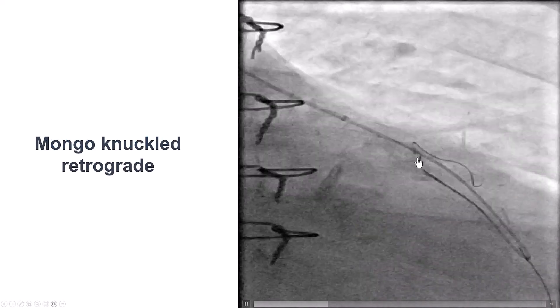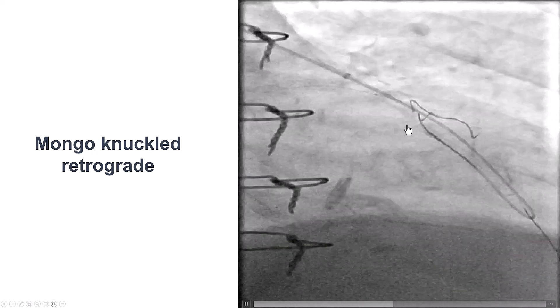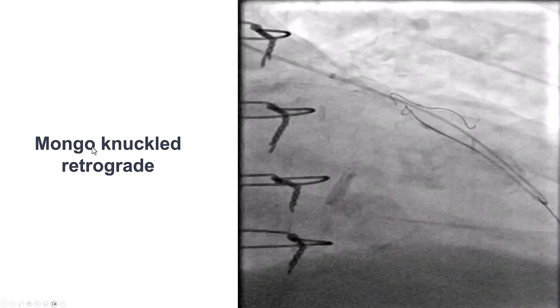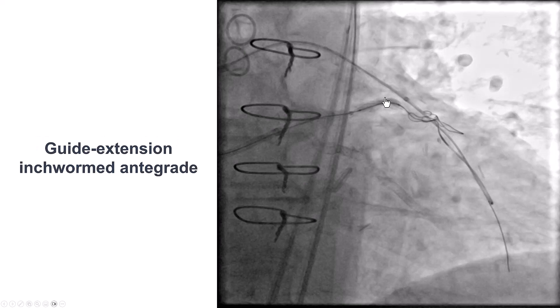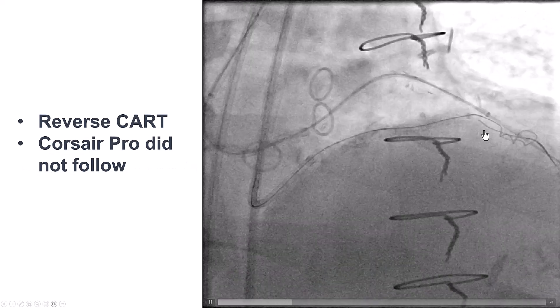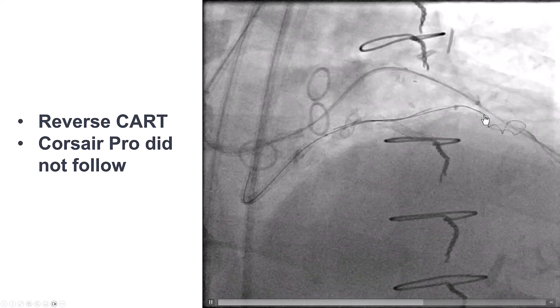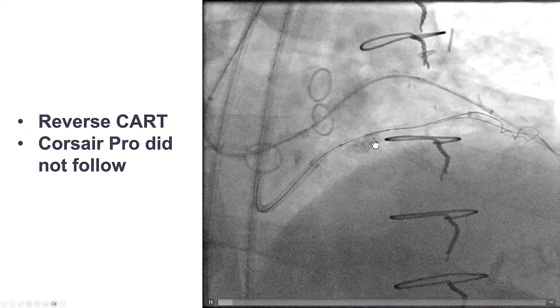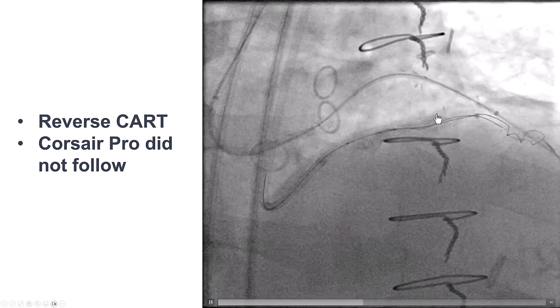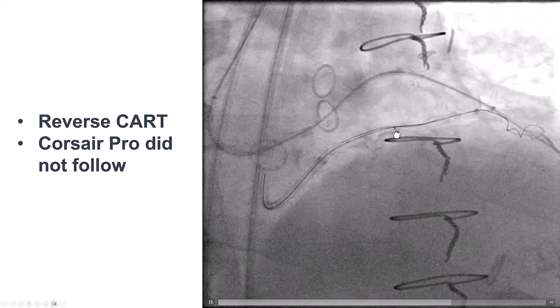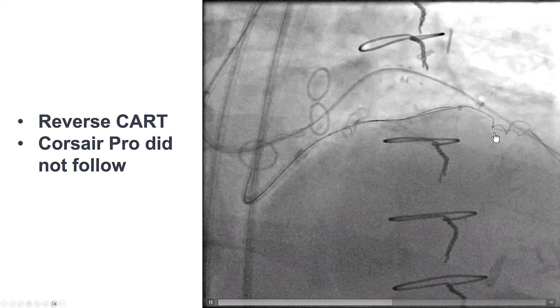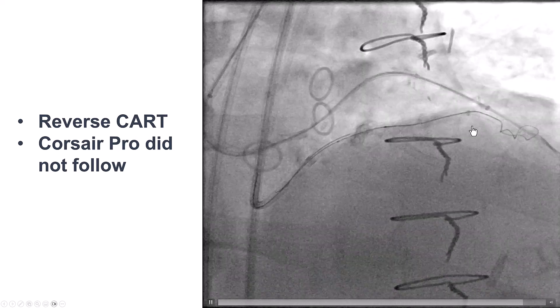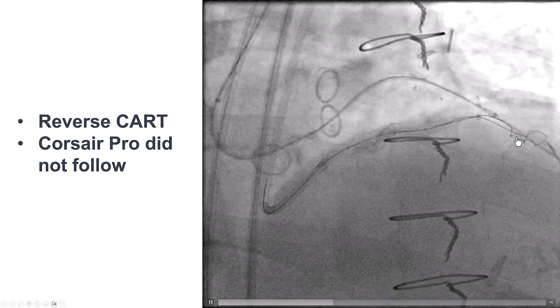Crossing the CTO was extremely challenging because of the calcium and tortuosity. We knuckled a Gladius Mongo guide wire, which seemed to advance along the course of the vessel. We then inserted an antegrade guide extension all the way to the proximal cap and performed the reverse CART, and we were able to advance the retrograde wire into the antegrade guide extension. However, despite trapping this retrograde wire, we were unable to advance the retrograde Corsair Pro into the guide extension, likely because of the significant calcium in this area.